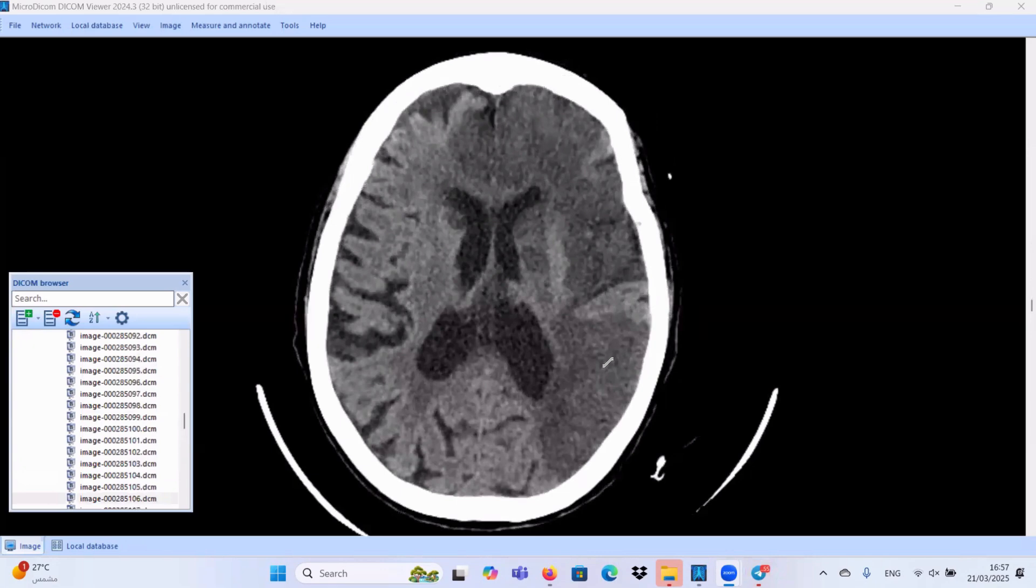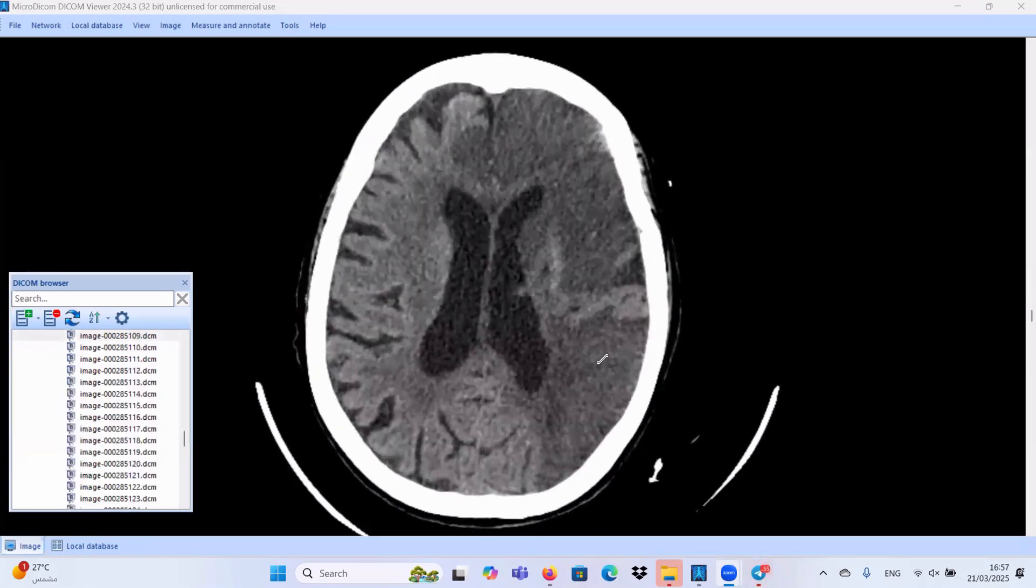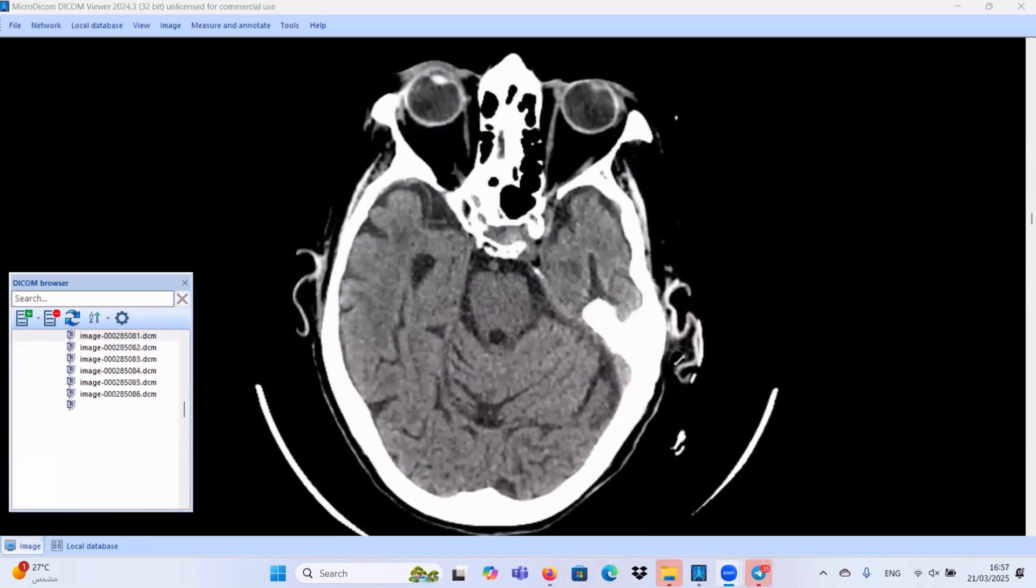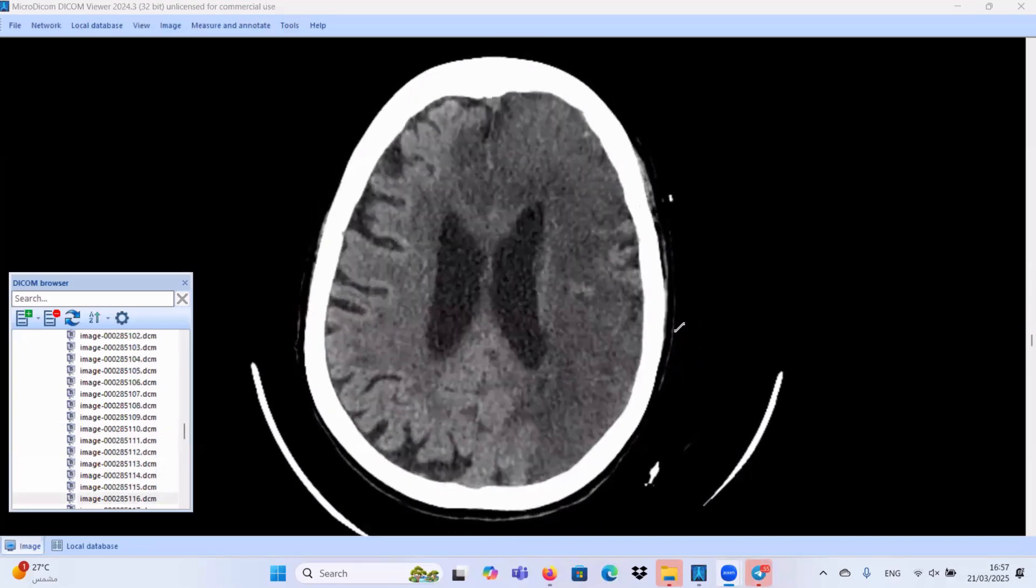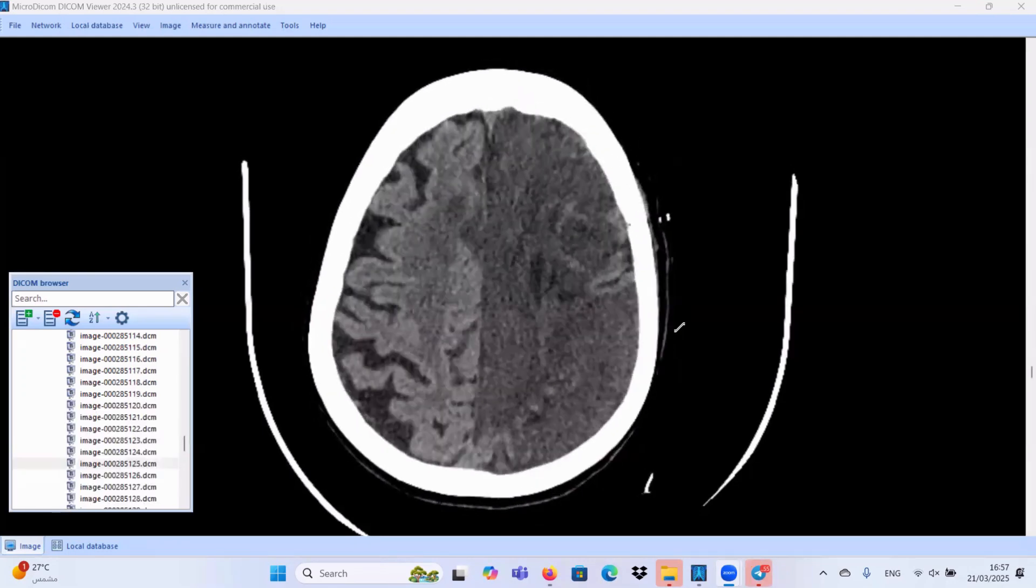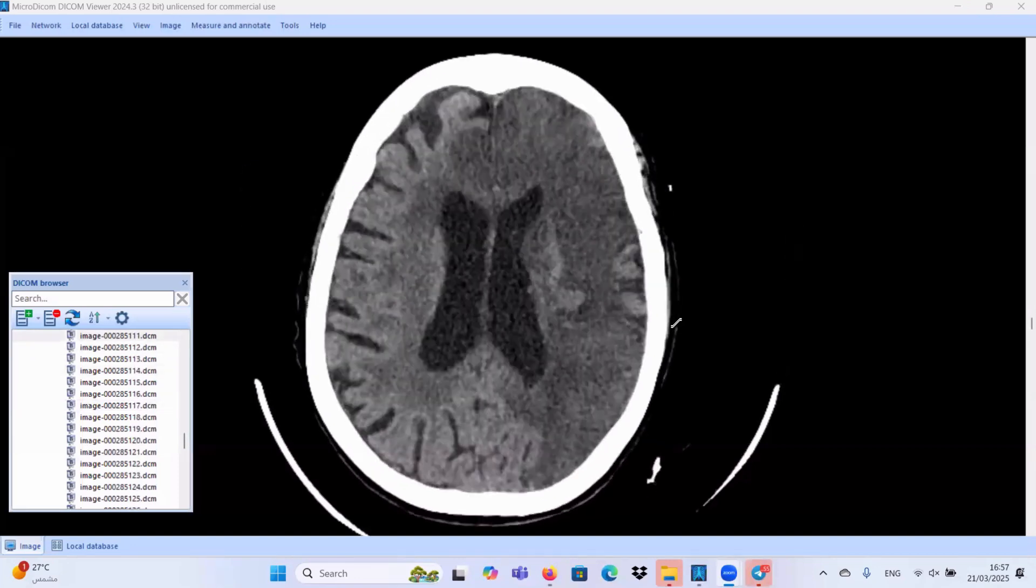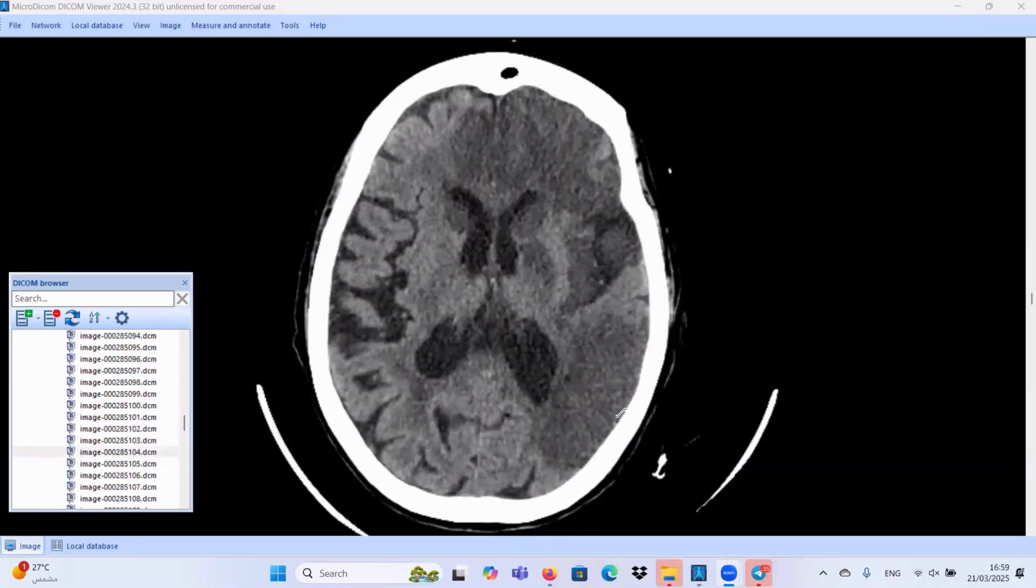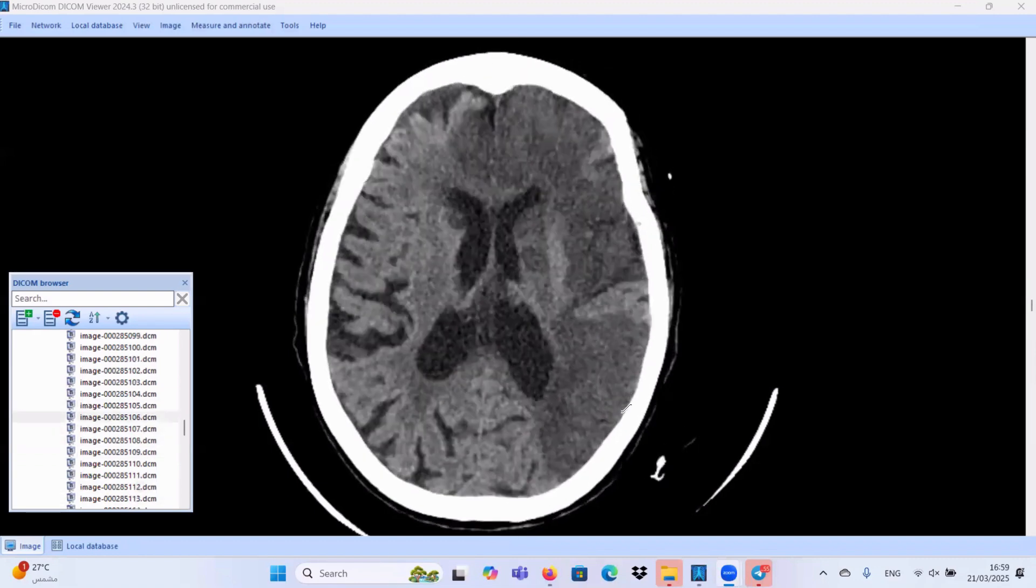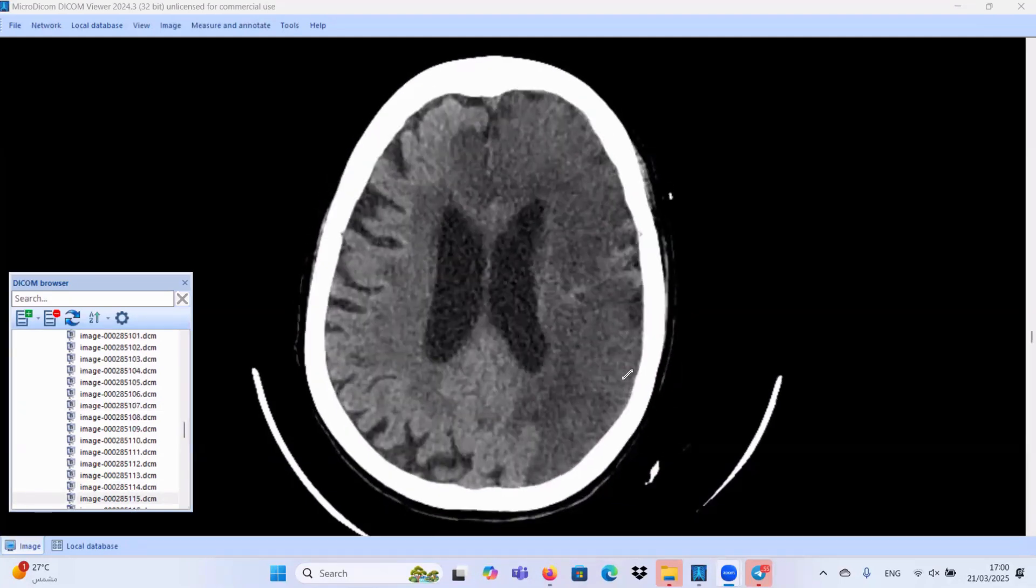So, our second case today, another patient that was presenting with acute loss of conscious level. And as you can see here, we have multiple hypodense patch areas involving many areas at the left cerebral hemisphere. Let's go in a systematic way. We have the left lentiform nucleus, the left insula, the left temporal region, the left frontal parietal region.